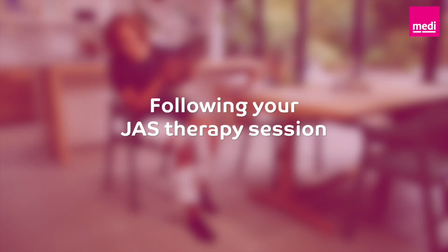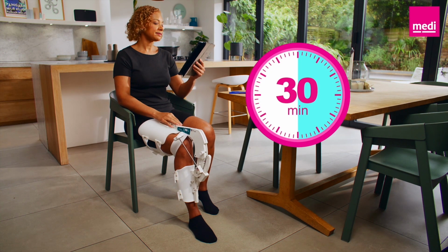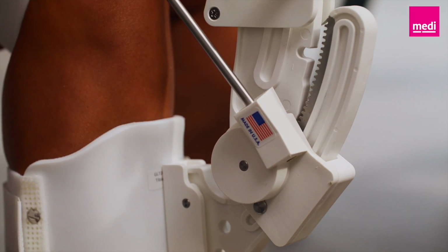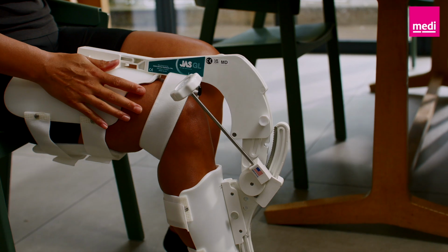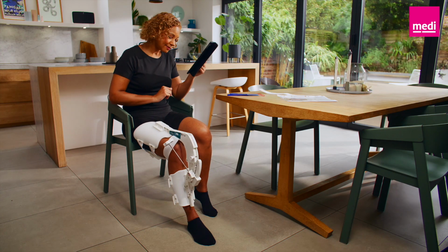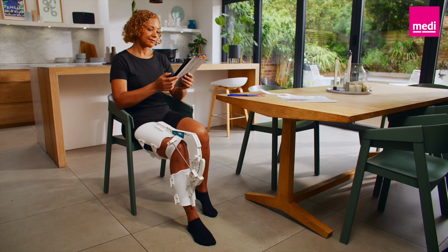Following your JAS therapy session. The recommended JAS therapy session is 30 minutes and is split into 6 5-minute stretches, during which you'll gently stretch your knee with the brace and hold the position. After each 5-minute stretch, pause and check the level of stretch you're feeling. Some people may be advised to start with shorter therapy sessions and gradually build up to 30 minutes. Please follow the treatment plan as recommended by your healthcare professional.